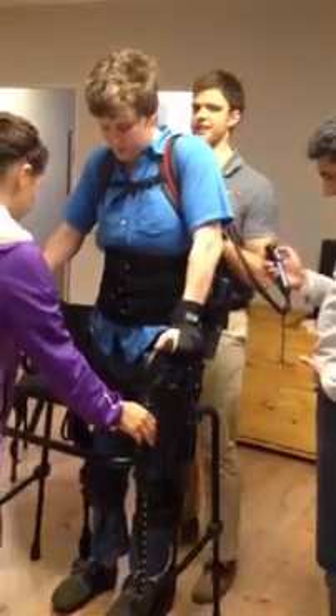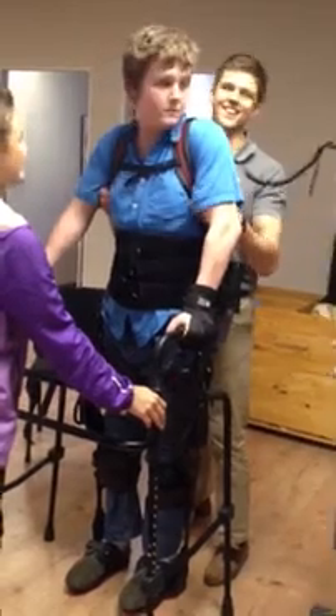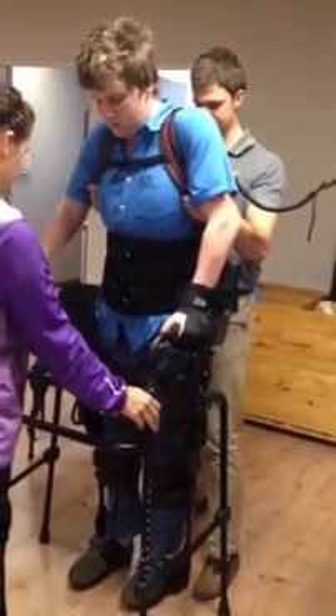Cancel, right? We go back. We got to use the pen — Brandon's made us lazy. Okay. Yep. All right. Strong. There we go.